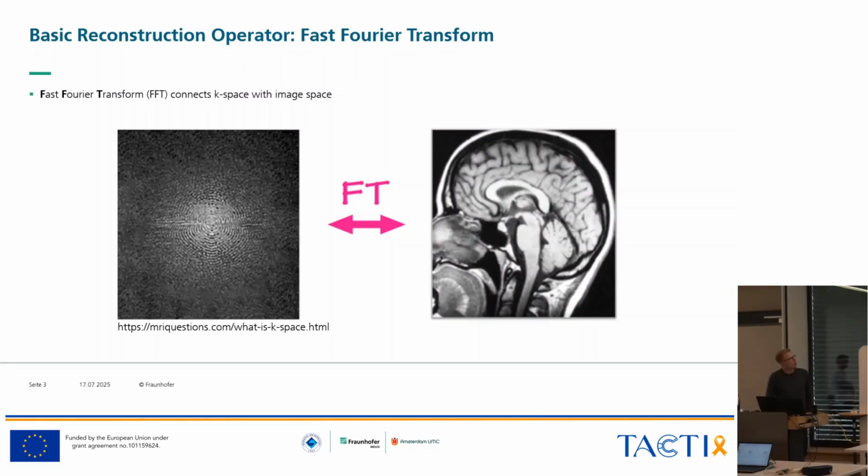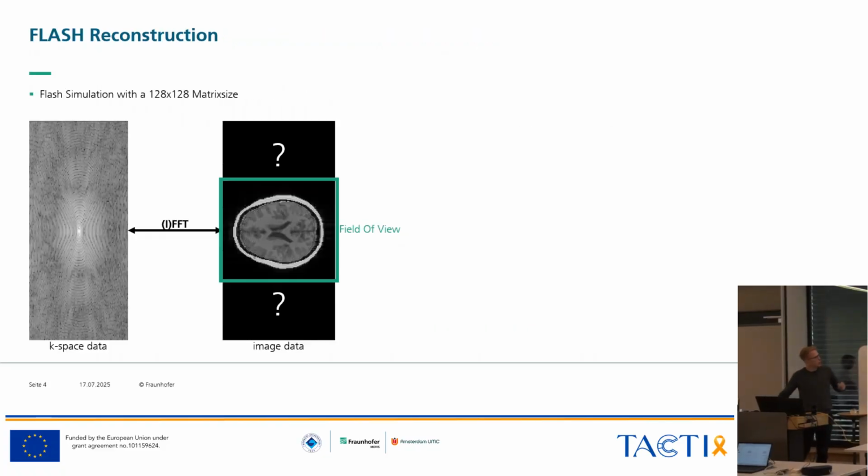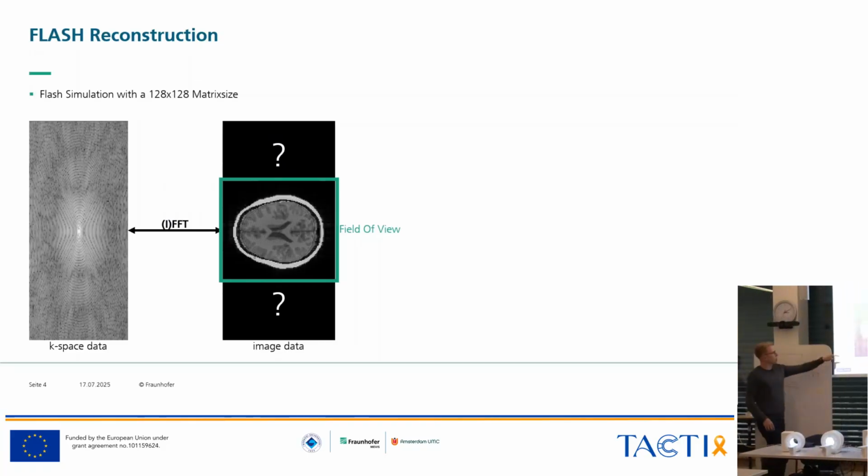Fortunately, the flash sequence, as Dan showed us, is quite simple, so it will acquire K-space line by line. So at least you end up with a somewhat reasonable K-space matrix in the end, but what you see is that it looks a little bit stretched into one direction, and this is exactly what we already saw. So we talked about these aliasing artifacts, and that MR systems usually apply a twofold oversampling in the readout direction, this direction.